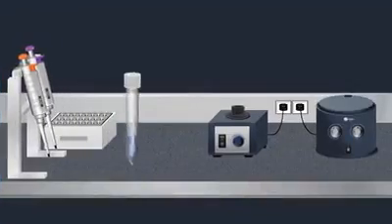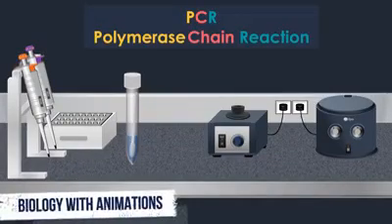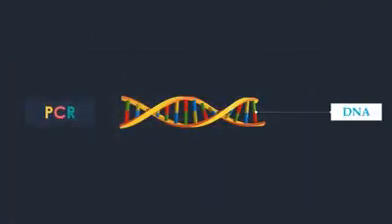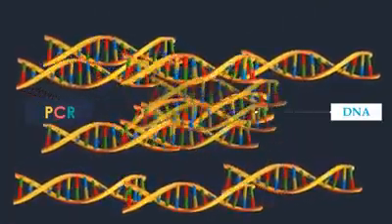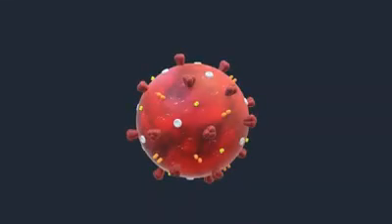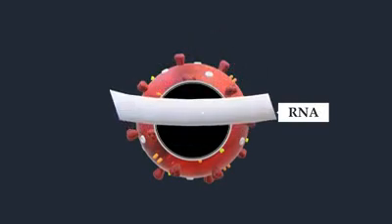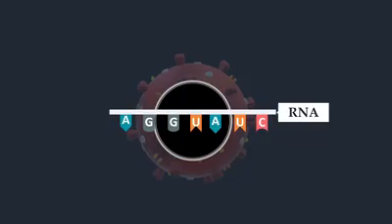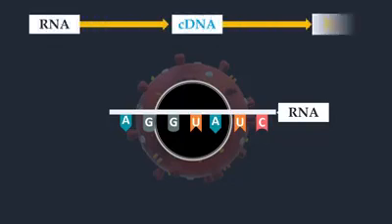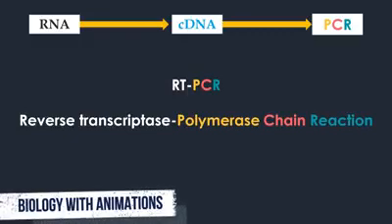The standard method of coronavirus testing is polymerase chain reaction, PCR, which is a method used widely in molecular biology to make millions to billions of copies of a specific DNA fragment rapidly. Coronaviruses contain an extraordinarily long single-stranded RNA genome. To detect these viruses with PCR, RNA molecules must be converted into their complementary DNA sequences by reverse transcriptase. Then the newly synthesized DNA can be amplified by standard PCR procedures. This approach is universally known as RT-PCR.